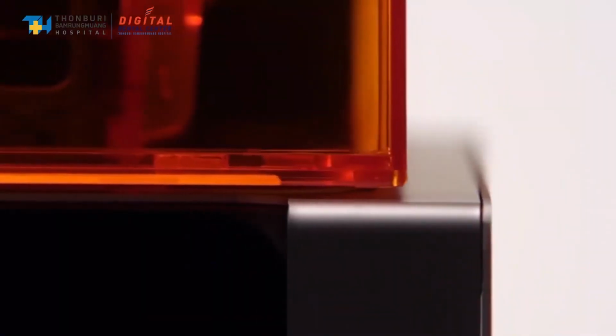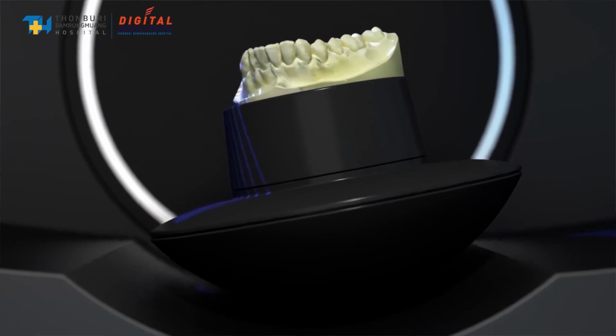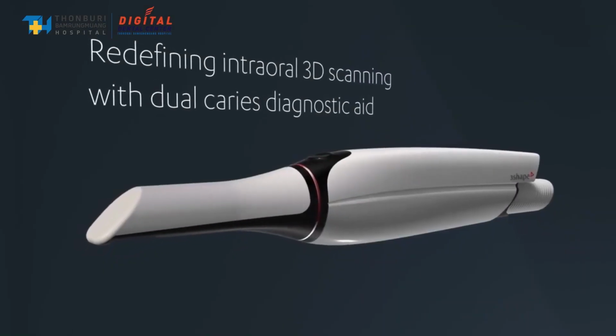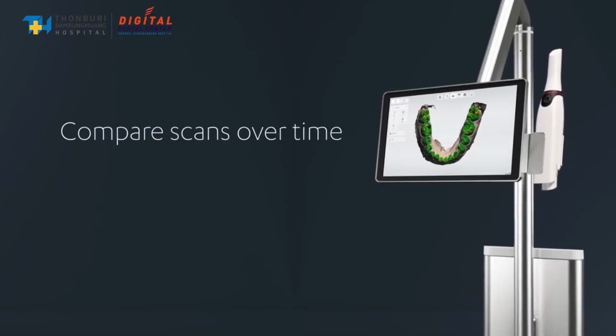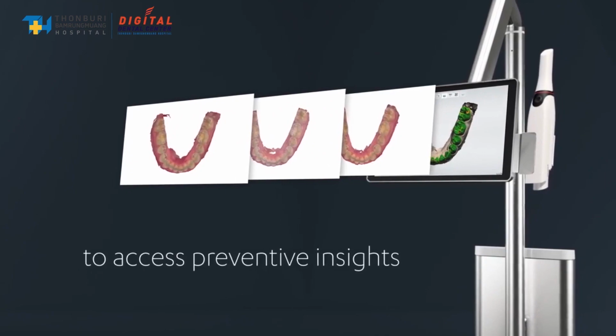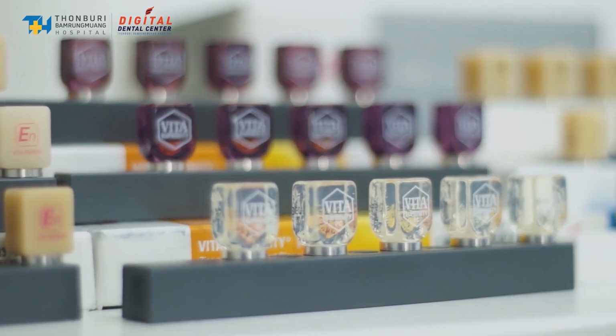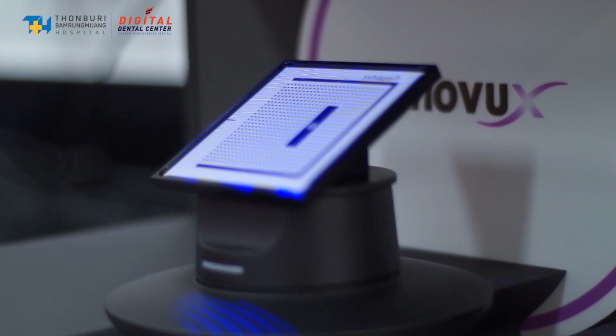The second benefit of digital is that you don't have to use any materials for impressions. That means you take a camera, make a picture inside of your mouth, send it to the computer, and then we design the restoration in the computer. After this, we put it into the milling machine, and around 20 to 25 minutes later, we can try that in your mouth, and after that, this is finished.